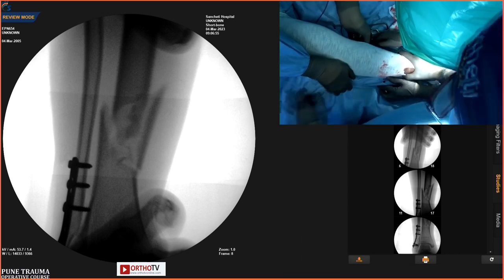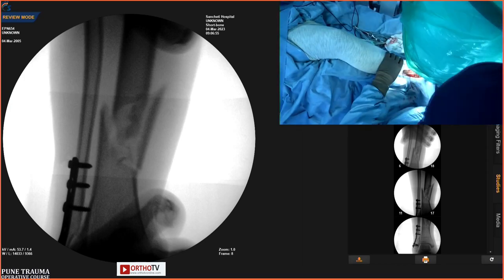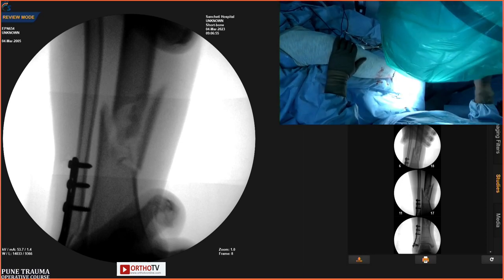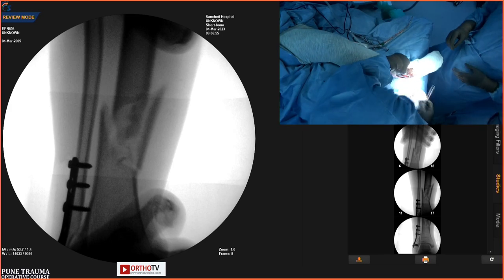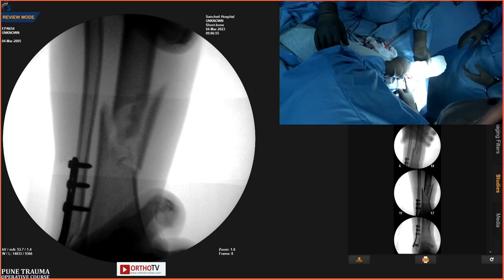Shiva, will you do anything differently now? Once we have done the fibula fixation already, it's a non-comminuted, oblique fibula, and the tibia has fallen into place now. What's your take now? What is the question?